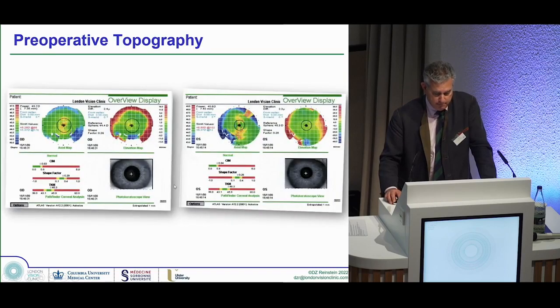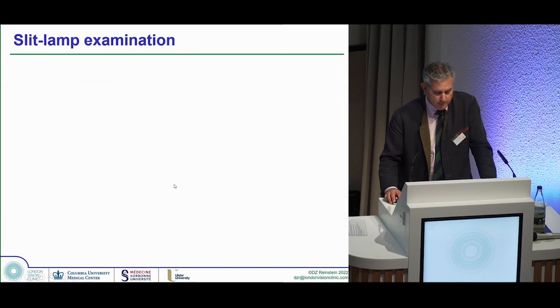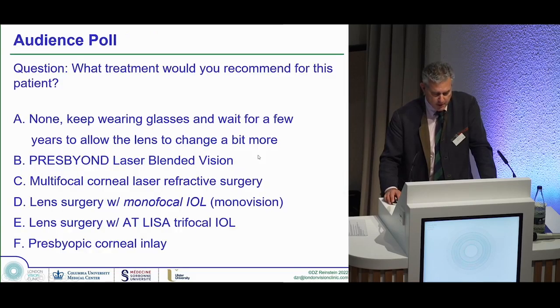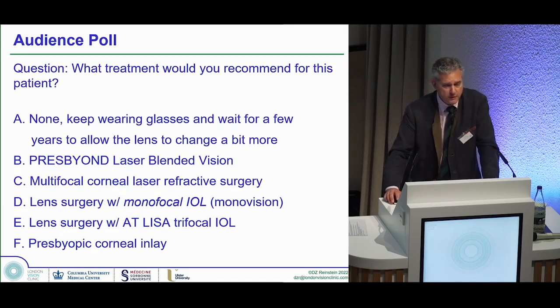And he had very nice corneas, no problem with that. His slit lamp exam showed little almonds inside his crystalline lens. Beautiful, beautiful cross sections. They're juicy. So, A, B, C, D, E, or F. How old is he? 68. 68, and real cataract, 20/50.